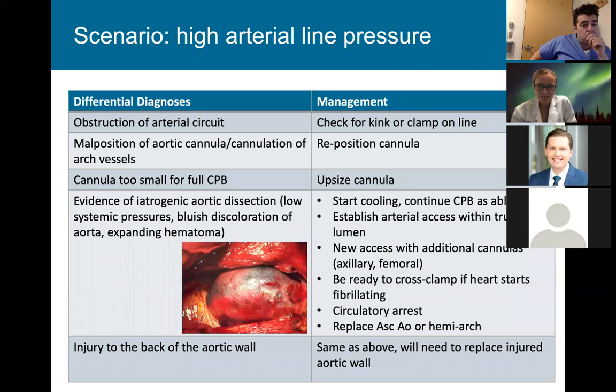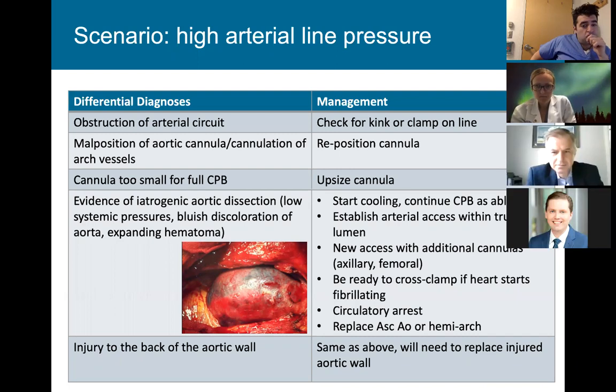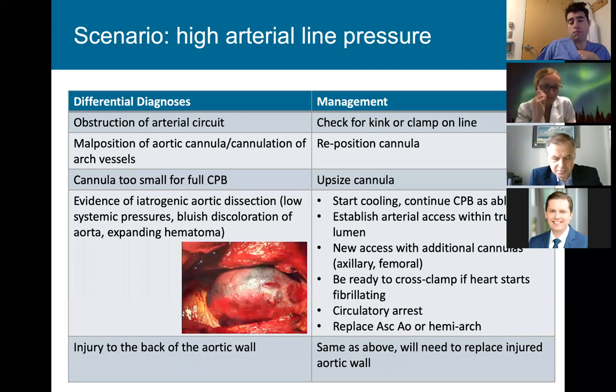Dr. Tola, just for clarity for myself, so when you mean come off bypass? Yes, absolutely. You've gone on bypass for 30 seconds. It was rough. It didn't go right. All you've done, the worst thing that you've done aside from the dissection, is remove volume from the patient from the venous line. Just give that volume back. Got it. Thank you.